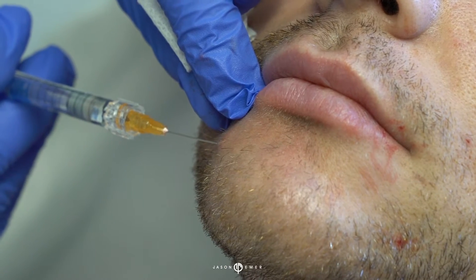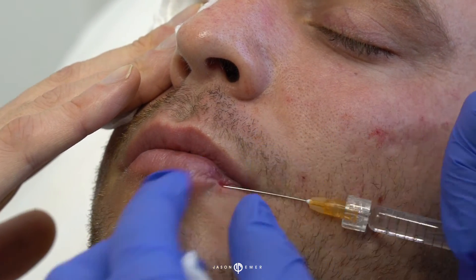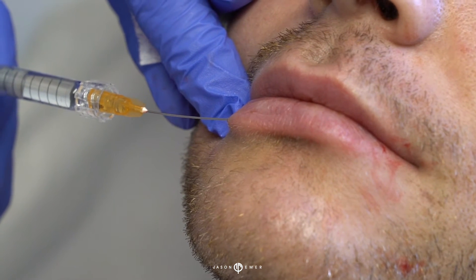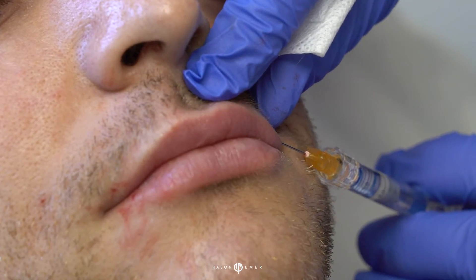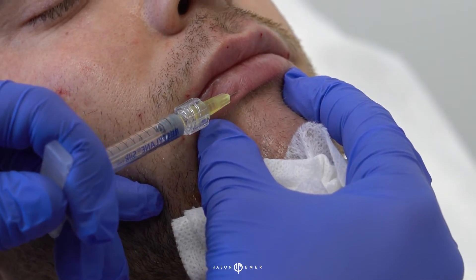It also gives a little bit of an upturn. For the lower lip we're using a different filler, Restylane Silk, which I like a lot because it's really soft and looks very natural. Filling a little bit more anterior on his lower lip — using the cannula helps us limit downtime. We're going to give him a little definition there for that upturn, and the same on the corners of his lips, just to get a little upturn there.